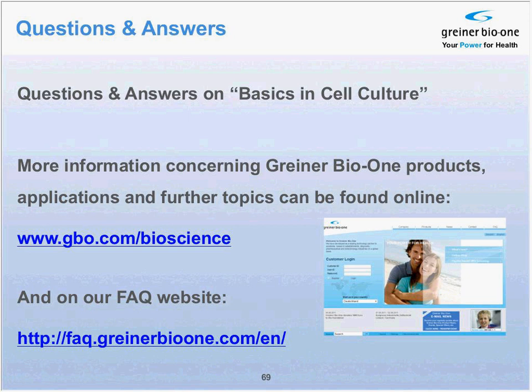Right. For cryopreservation, do you prefer vials with the threads on the outside of the tube or the internal threads? Because this person has vials explode during warming, and they've heard that the internal threads might fix this problem. Actually, it doesn't matter which type you use. Some people like external thread, some internal thread.